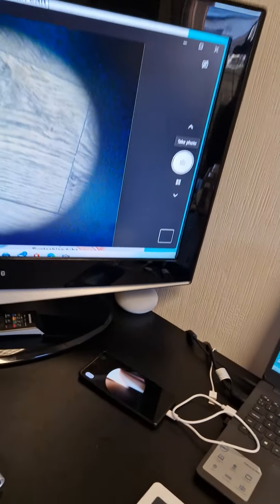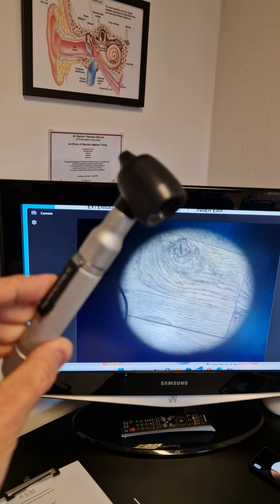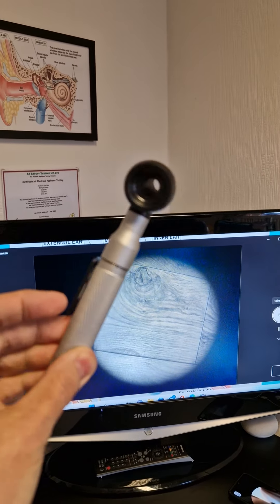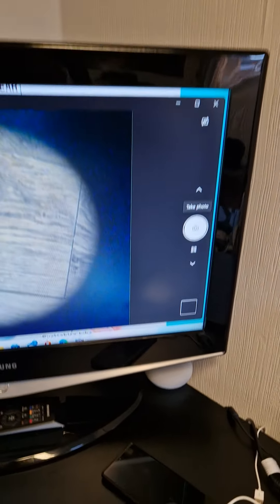What you might have seen in the past are these otoscopes — these are the old-fashioned ones that we use in emergencies. Computers do break sometimes, so these are the ones that your GP would use to look inside your ear.